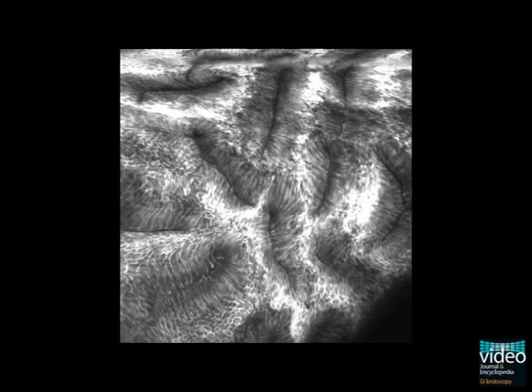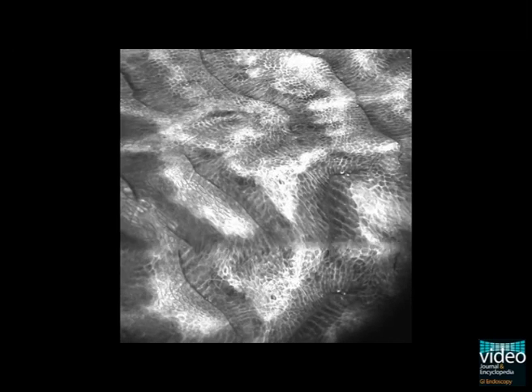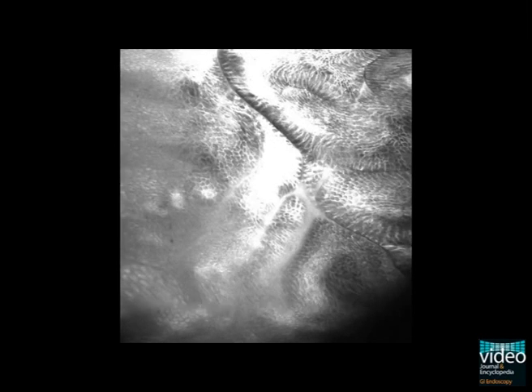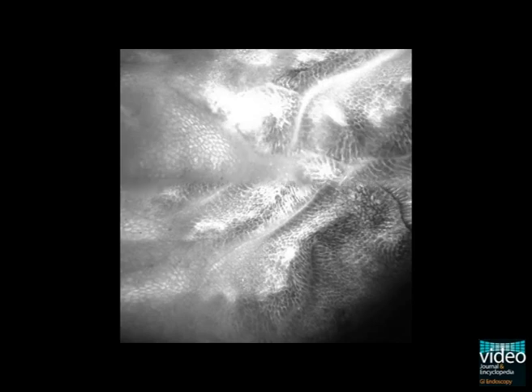The typical cobblestone appearance of gastric mucosa is seen. The endomicroscopic image has an edge length of 475 micrometers, representing an approximately 1,000-fold magnification in vivo.